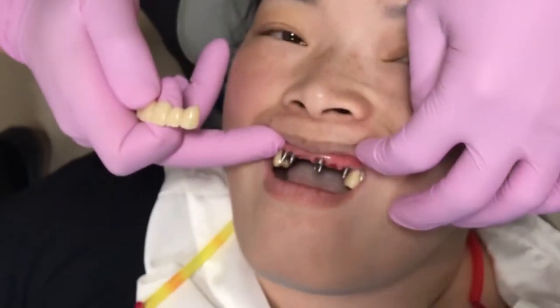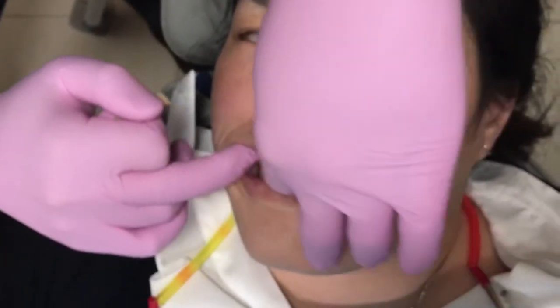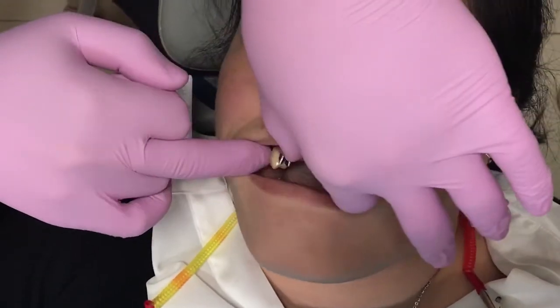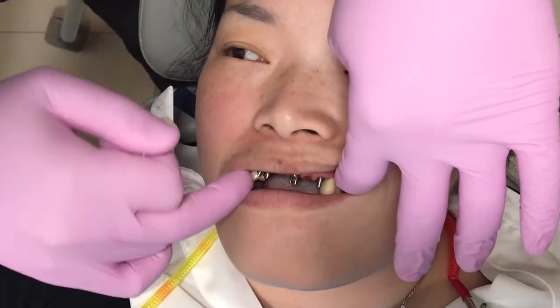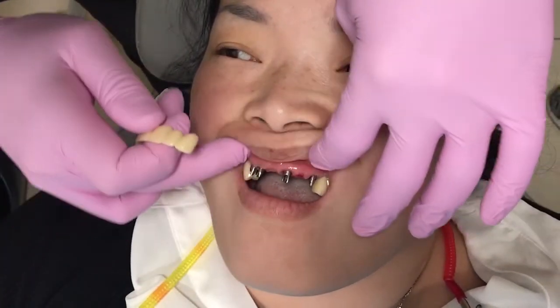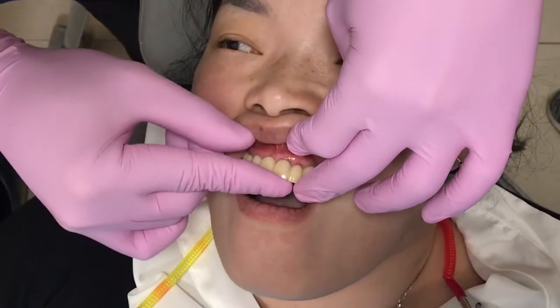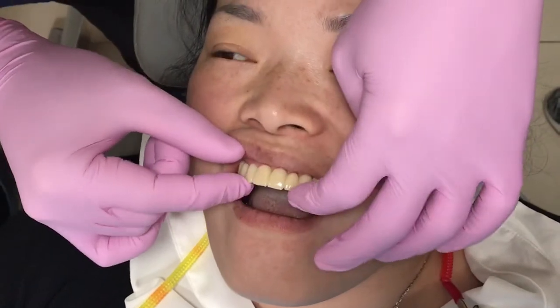As you can see, there are four abutments. Posteriorly, there are four implants on the right side and four implants on the left side, and four implant crowns. In the front, there are four implant abutments, and this is the final restoration.